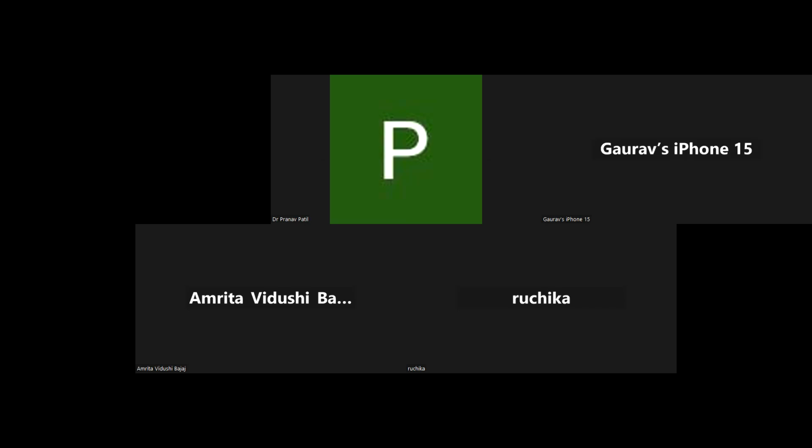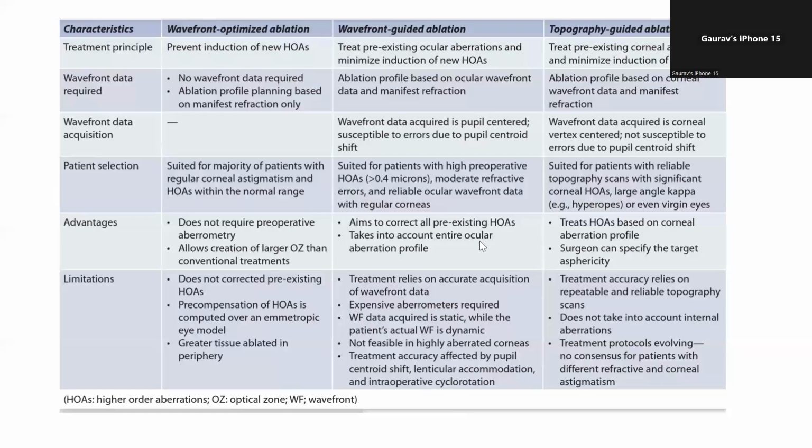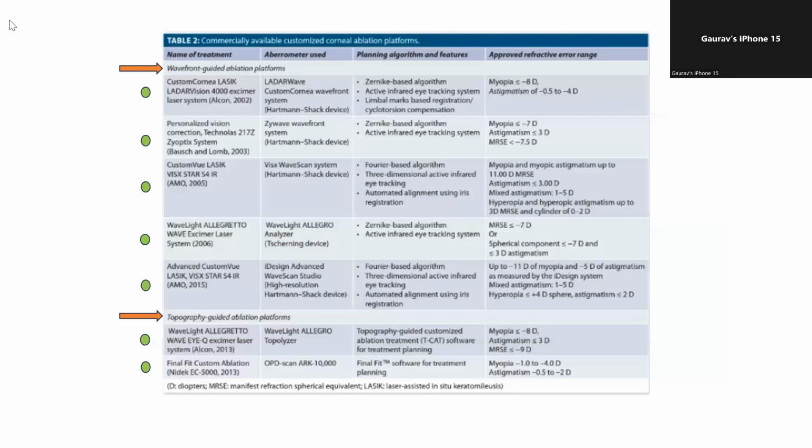So the laser energy delivered in the mid periphery of the cornea had two things happening. One was that the spot was no longer the same round spot falling on the center, so the energy was less and spread out over a bigger area. Also, there was reflectance. When you hit straight from the top, there was very little reflectance, so the effect was full. Whereas in the peripheral cornea, some of the beams were reflected off because they fell obliquely. So the effect of the laser spots in the periphery was much smaller than in the center, and the treatment was less in the periphery as compared to the center.